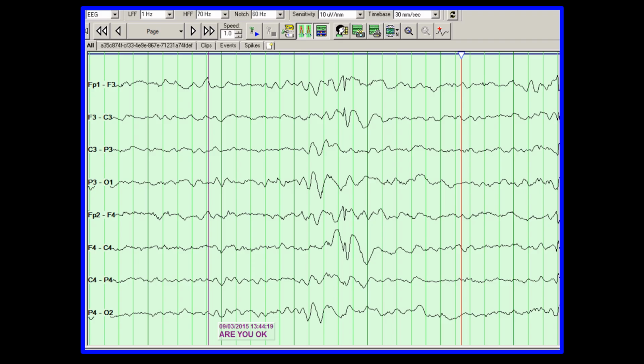An epoch in EEG lingo refers to a segment of time, let's say as it is in this frame 6.6 seconds or more, commonly 10 seconds, chosen by the electroencephalographer as the unit of time to partition the entire record for reviewing and description.